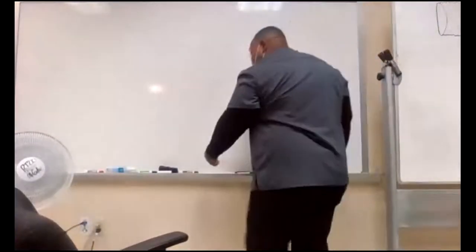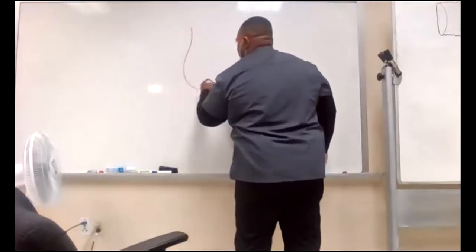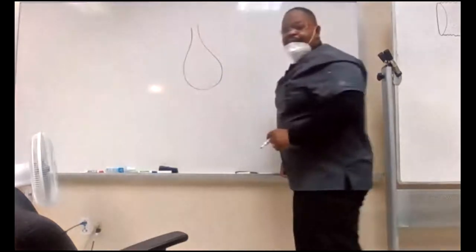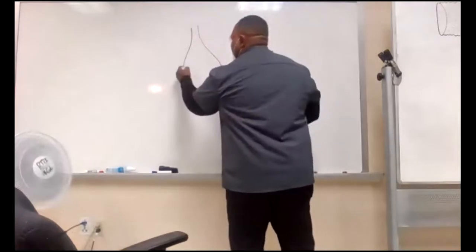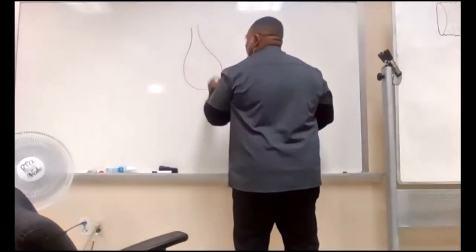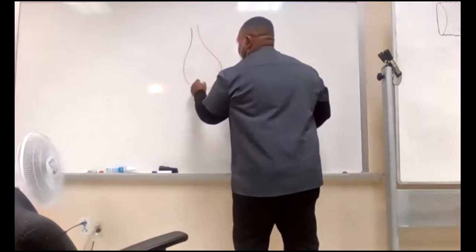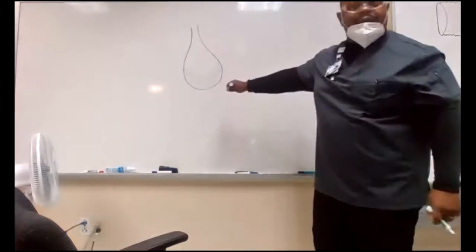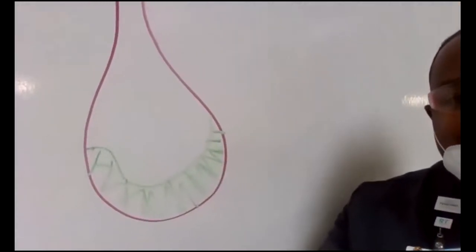But on the PEP, I just want to show you, on the PEP device, what's happening. This is the alveoli. Right? If that's the alveoli, and I have green secretions all in there. So say I have secretions in my alveoli. Well, that's causing a problem, right? Them green secretions right there in my alveoli, right?